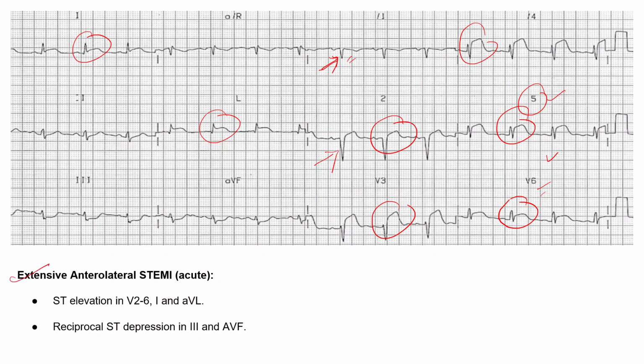So in case of MI, whenever you are trying to read the ECG of MI, you have to always look for the contiguous leads. You can start with the precordial leads V1 to V6, and you know the patterns, and then you can look at lead 1 and AVL to characterize the high lateral wall MI, and finally you can look at 2, 3, AVF, which corresponds to the inferior wall. If there is ST elevation in these contiguous leads, accordingly you can tell the diagnosis.